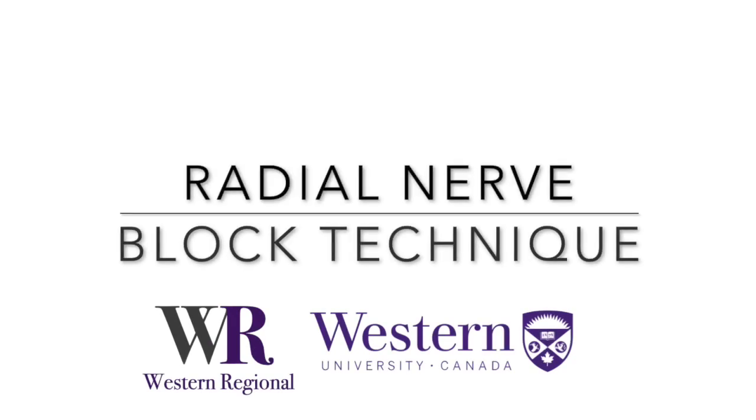In this video, we will review the ultrasound guided radial nerve block.